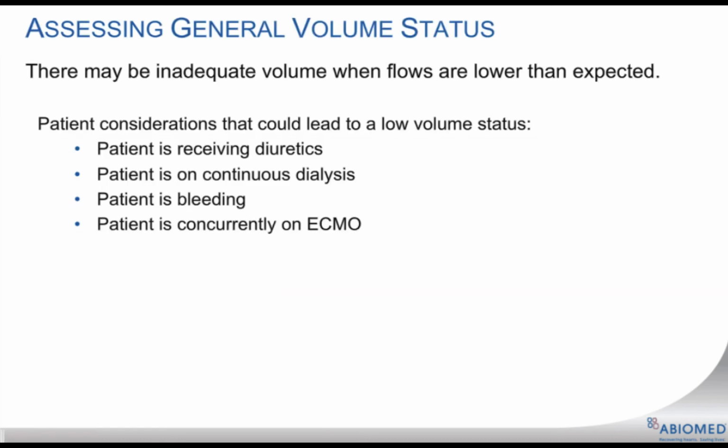Several conditions could lead to a low volume status. These include administration of diuretics, dialysis, bleeding conditions, and when a patient is on a VA ECMO.